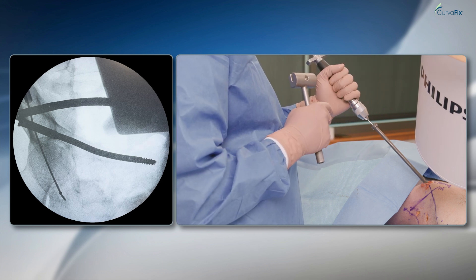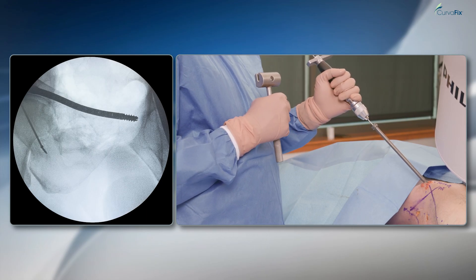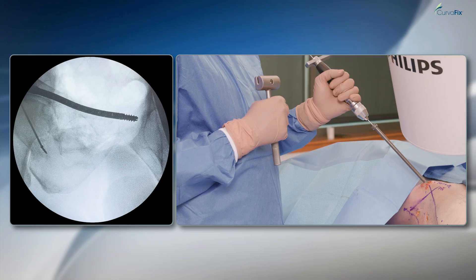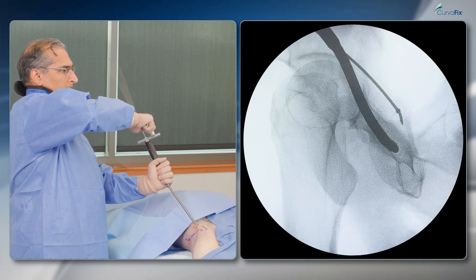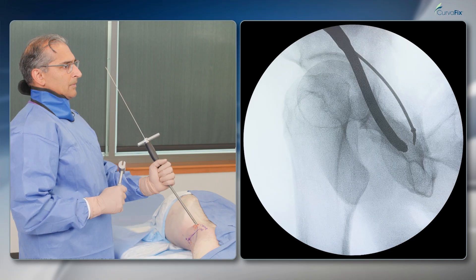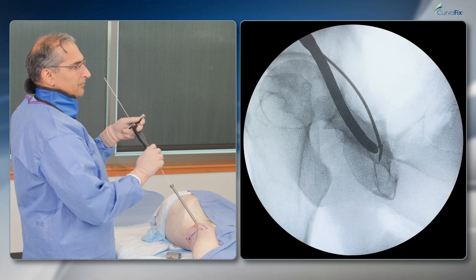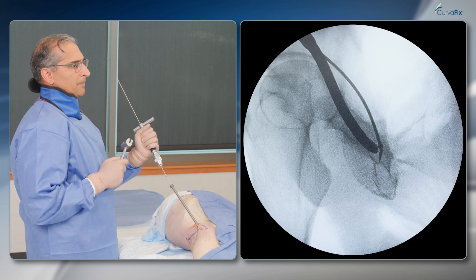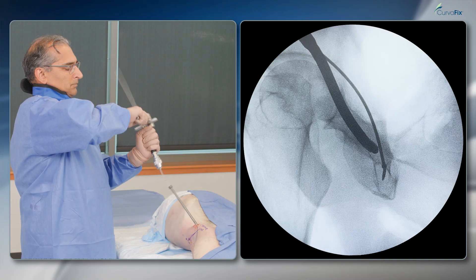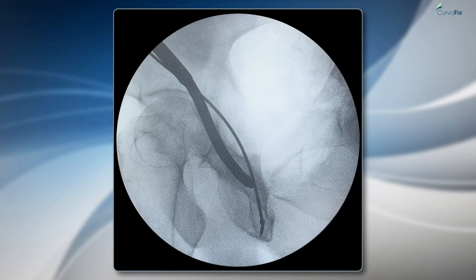Now you can see I'm coming more distal — I'm in the ischial tuberosity. On the other view I should be around the acetabulum and heading down the ischial tuberosity as well, making sure I'm posterior to the femoral head and in the posterior column. You can see it curving down that column and bending into that distal ischial tuberosity. I can seat that all the way down. The acetabulum is safe, with the wire in the right orientation.